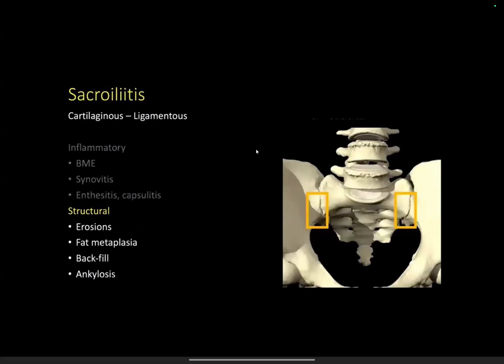But to be very true to you guys, we have lots of situations where we are stuck and not sure which category to put it into only on MRI, because you cannot see erosions that well, which is a good clue that you are dealing with chronic sacroiliitis. Yeah, that's true. These two findings being coexistently present do confuse us with sacroiliitis also.